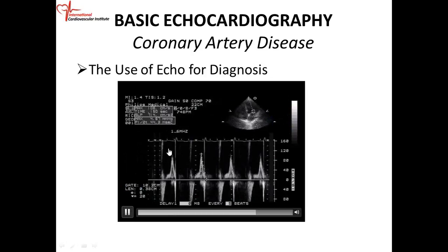Again, you can see there's a tiny E, a fairly big A. So in this patient, we can grade the amount of diastolic dysfunction.